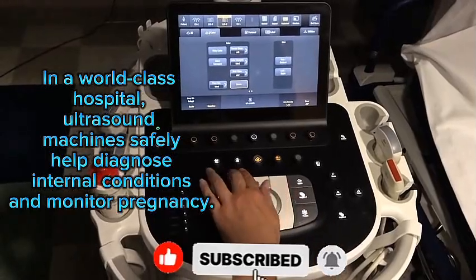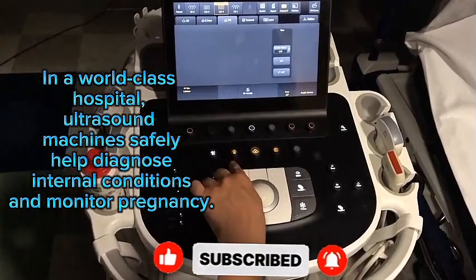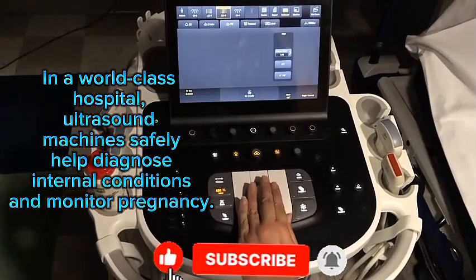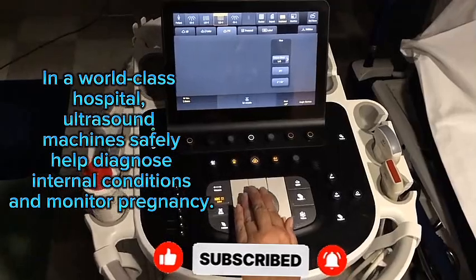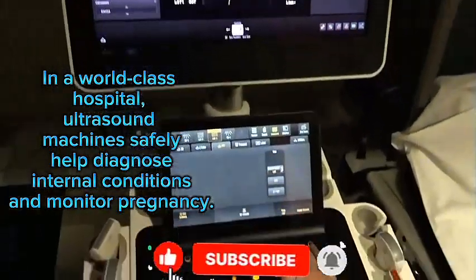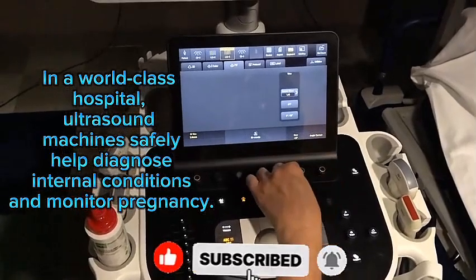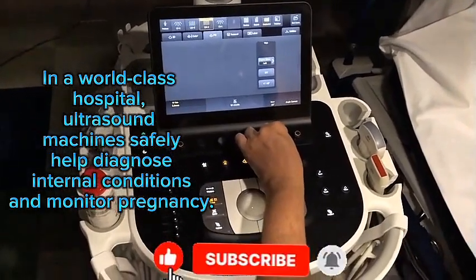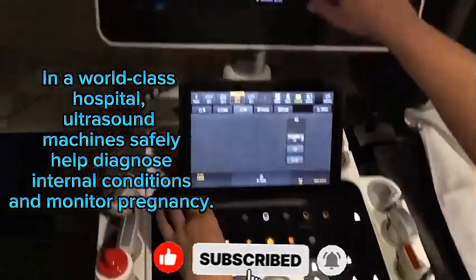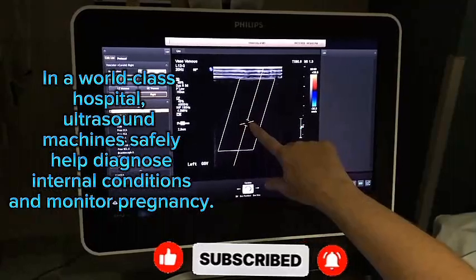If you want a waveform, you will hit pulse wave button. You select the button. It will turn orange because it is engaged. Then the mouse is controlling your sample box position, and then these buttons up here now are for the pulse wave, so you can change your angle of your sample box. You can steer the Doppler. Here you can change the size of your sample that you're getting, a very small sample or a large sample.